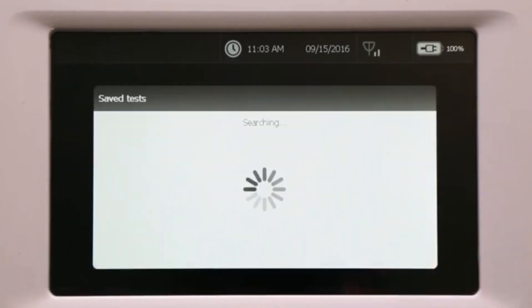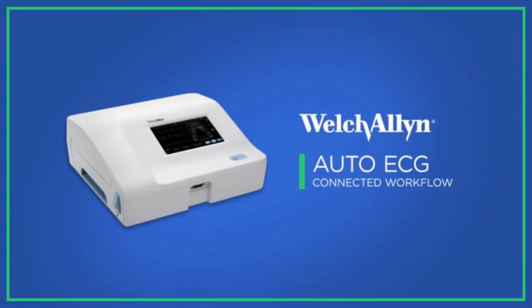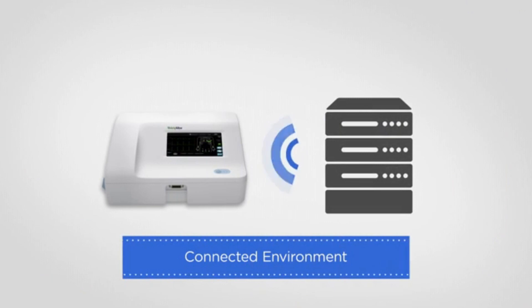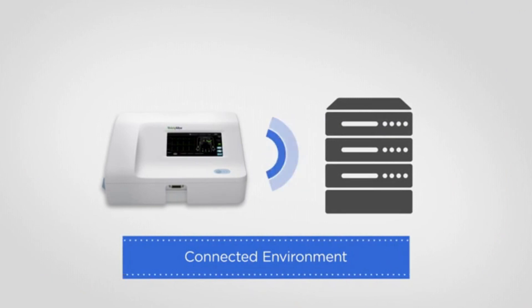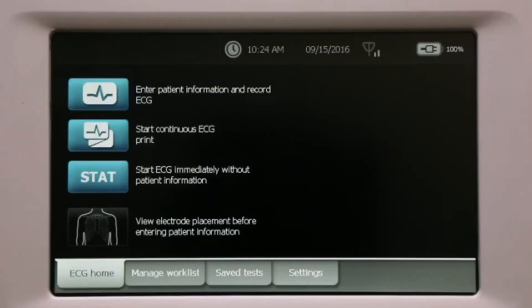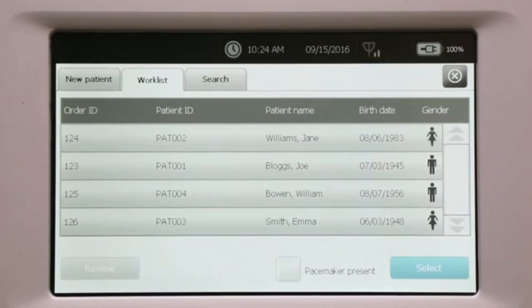Any tests saved in local device memory can be retrieved by going to the Saved Test tab. In a connected environment, the patient worklist is automatically populated in the device from a DICOM worklist server. To initiate an ECG test, touch ECG and the worklist automatically downloads the list of patients scheduled for ECGs.